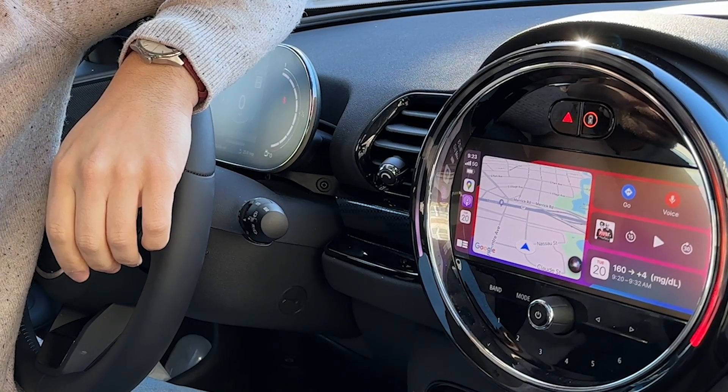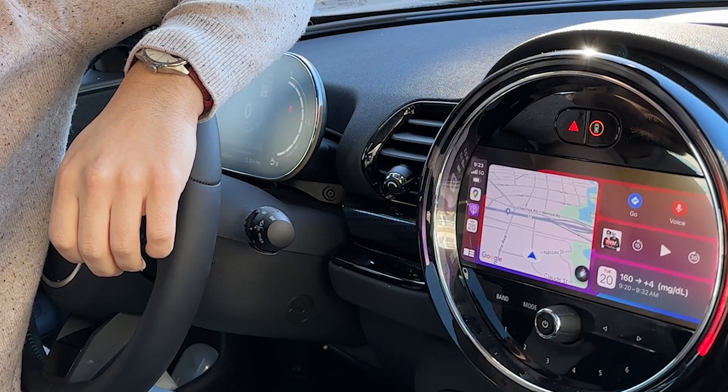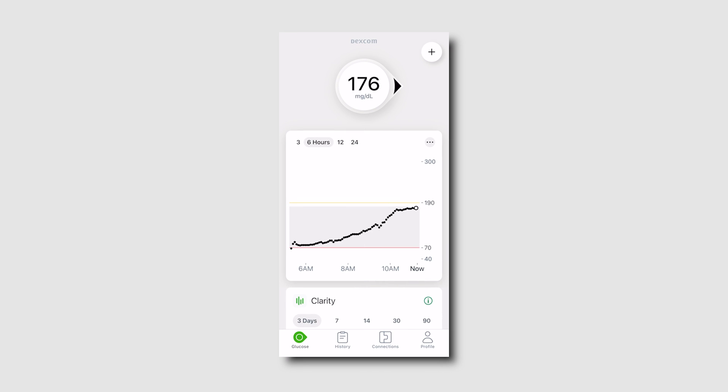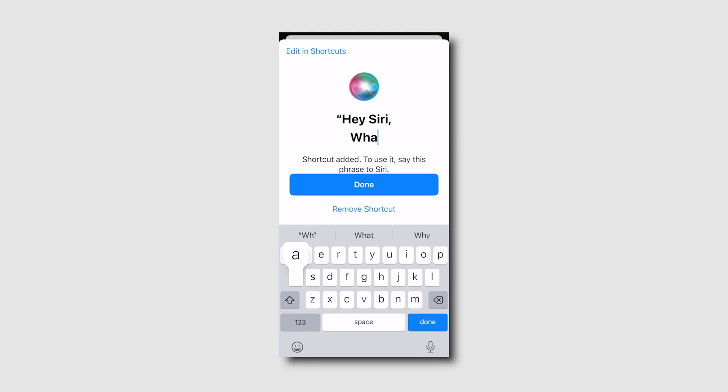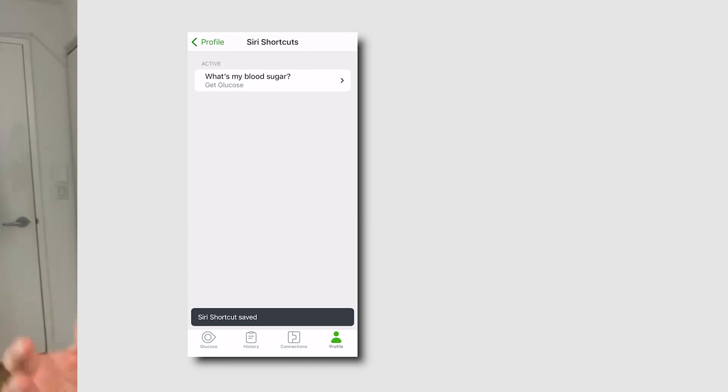Here's what it sounds like. Hey Siri, what is my blood sugar? You're 160 and steady. Siri was reading my Dexcom readings directly from the Dexcom app, giving that little added bit of information that my blood glucose is steady. Setting up a Siri phrase can be done with both Dexcom G6 and G7. On the Dexcom G7 app, go to the Profile tab and tap on Siri Shortcuts. You can edit the recommended phrase — I chose 'what is my blood sugar' because it's more natural. Not only will Siri work in the car, but it works with all Apple devices, whether it's your phone, Apple Watch, computer Siri, or the HomePod mini.